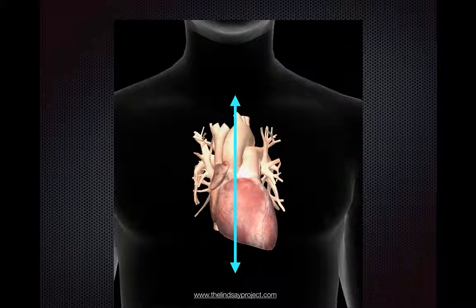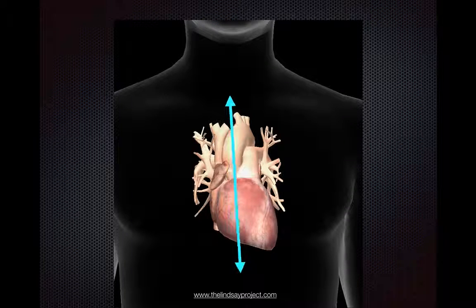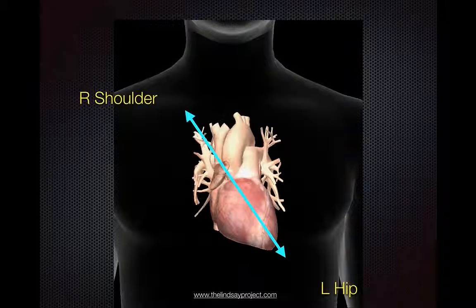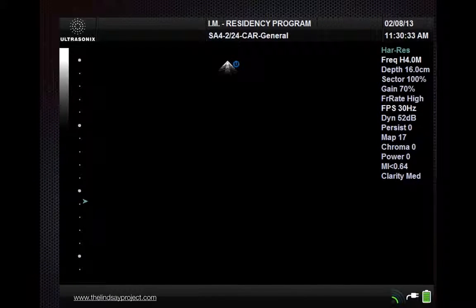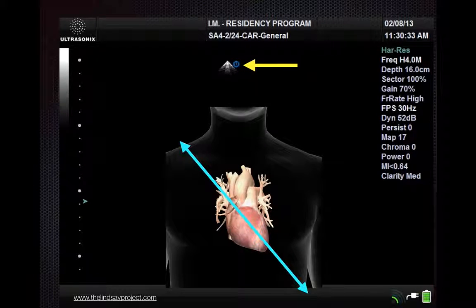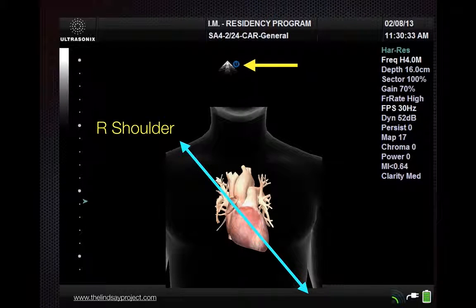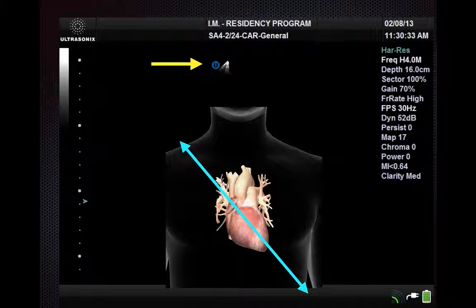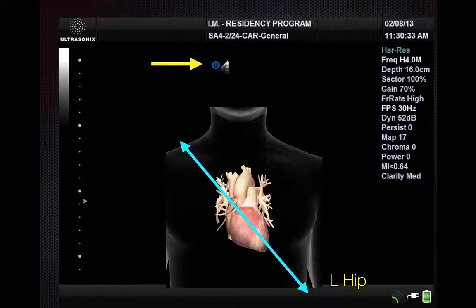In my previous tutorial on parasternal long axis cardiac imaging, I mentioned that you're going to be pointing the transducer marker either to the patient's right shoulder or to the patient's left hip. More specifically, if your screen marker is on the right-hand side of the screen, then you're going to point the transducer marker to the patient's right shoulder. If your screen marker is on the left-hand side of the screen, then you're going to point the transducer marker to the patient's left hip.